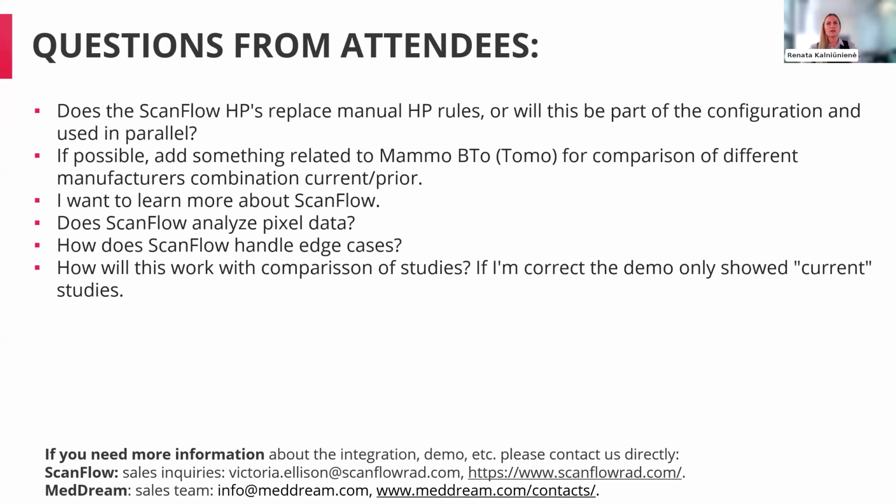Reed, are you going to add to the first question? Yes, I agree with Marius. ScanFlow creates its own set of hanging protocol logic within MedDream's configuration framework. When a study comes in, ScanFlow's intelligent matching may be the option applied based on the radiologist's preference, and the existing manual rules are not deleted or replaced. Institutions do not need to change their existing setup to adopt ScanFlow. It's on a per radiologist basis.